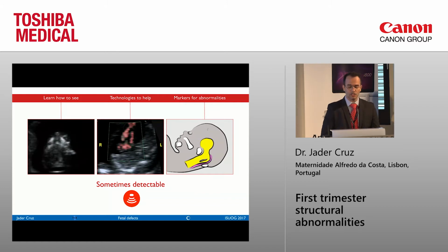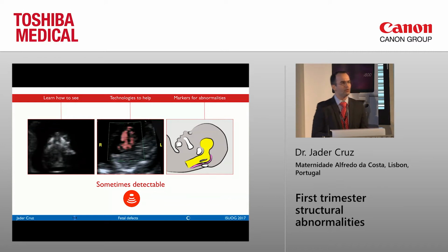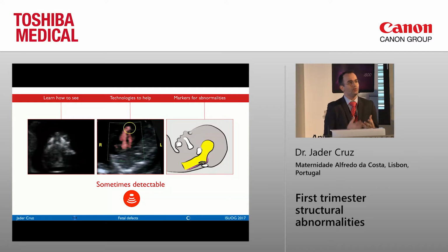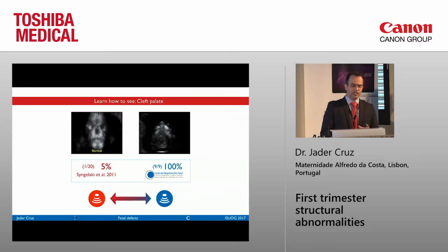of these abnormalities. And I just show here the example of what happens when you have an open spina bifida. You all know the brain is pushed back and down, and therefore the brainstem compresses the posterior fossa. So by measuring either the fourth ventricle, called the intracranial translucency, or making a relation between the posterior fossa and the brainstem, you can actually think of an open spina bifida.